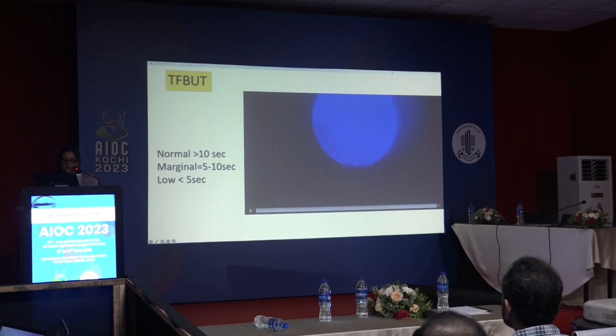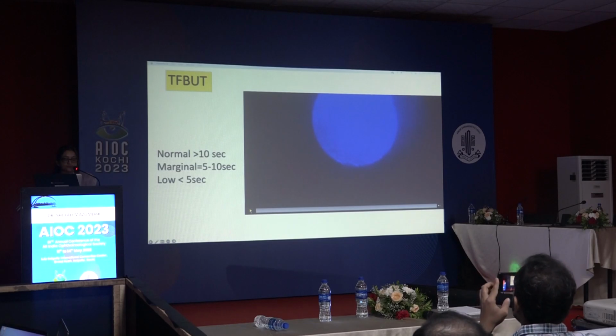So this is again a small video showing how you should measure the tear film breakup time.